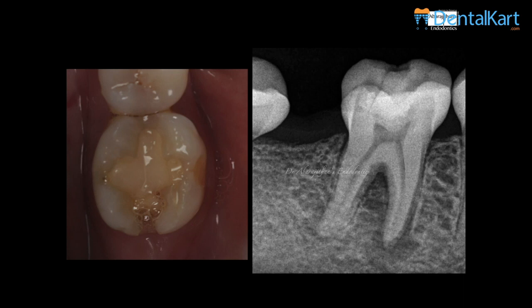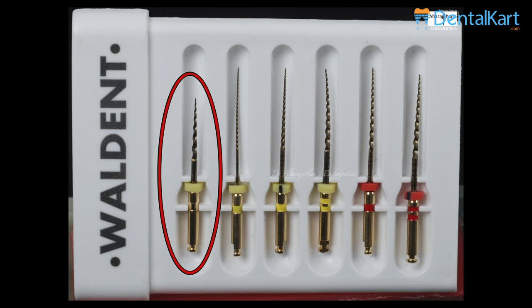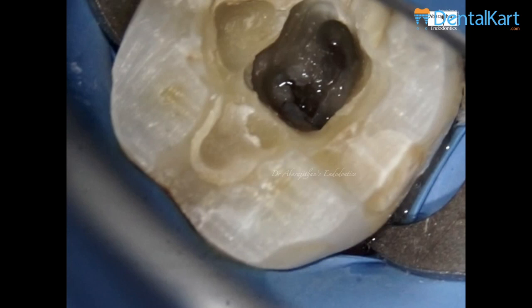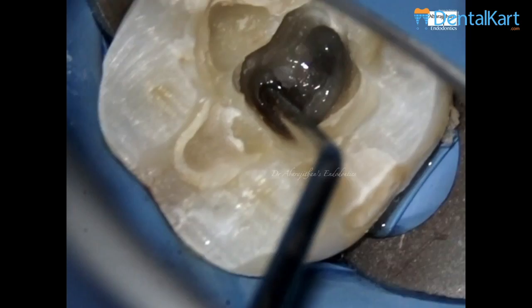This is case number one — the first case, a mandibular 4-6 with a lesion which had a crack that did not extend to the pulp chamber, so it can still be saved with root canal treatment. Upon initial access this is what we found. In this particular demonstration I did not use any hand files, because that would be the best way to evaluate the efficiency of the file.